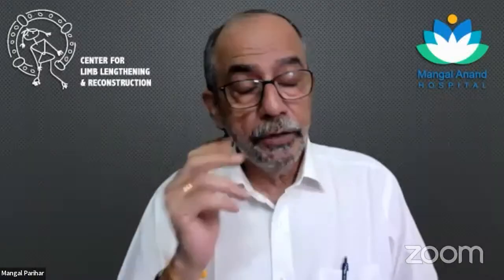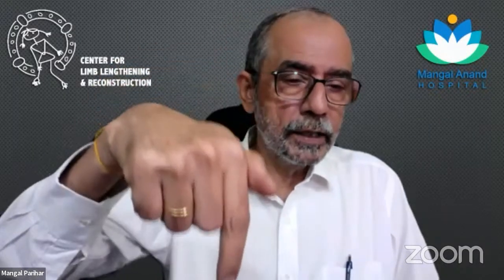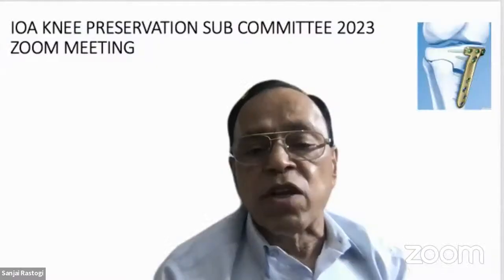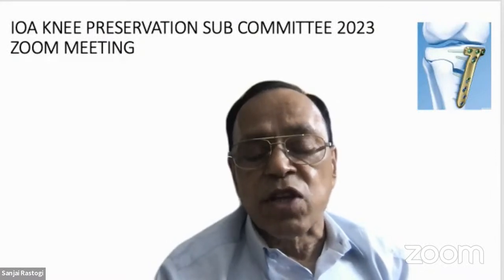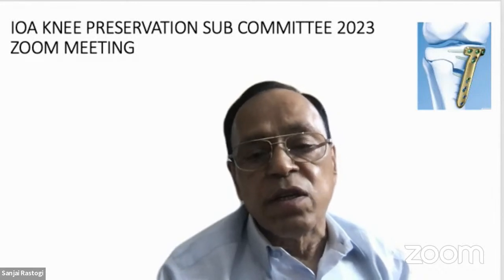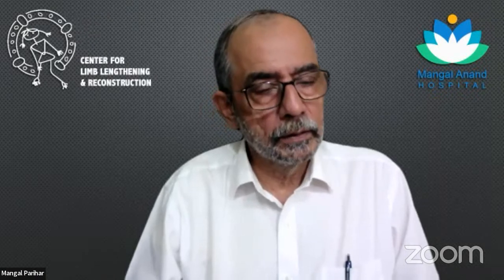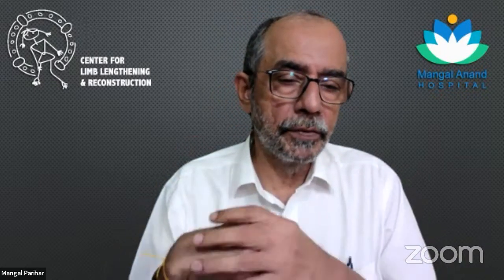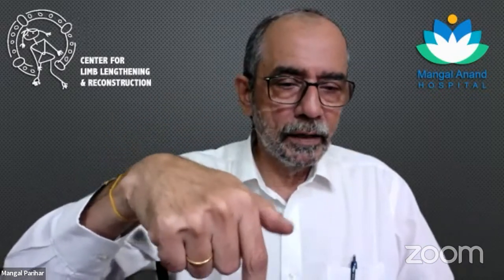Right. So, what is the advantage of pie crusting once you have released it? Even after release, sometimes if you've done a large correction, you can't insert your finger between the plate and the MCL. It gets actually strangulated. I'm talking of a distal release, not a transverse release. The distal release is, you see, it gets attached at 5 to 6 centimeters from the joint line. As you retract the pes, you are in the bursa, and from there you can release it distally. So distal release will work, but if you're doing a large correction, then sometimes you need further release of it. You've done the distal release, you've done the correction, and then you put the plate in. And then when I put my finger inside, the tendon is really stretched against my finger. Then I will do a pie crusting.